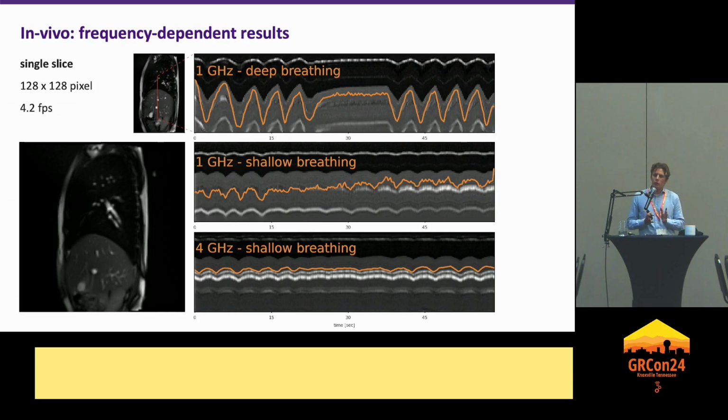And one interesting thing is that the so-called noise at 1 gigahertz, we think maybe this is motion from inside the body, maybe the heartbeat, some organs moving back and forth. So one of our aims is to decipher what we're capturing here.